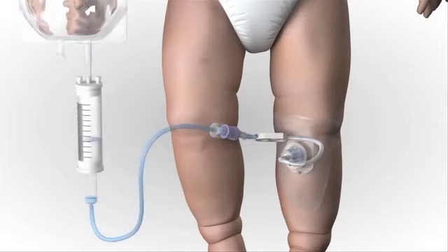Connect fluids if ordered. Infusion may need to be pressurized to achieve desired rate. Assess frequently for any signs of infiltration, extravasation, or other complications. Compartment syndrome is a serious complication that can result from unrecognized infiltration, extravasation.